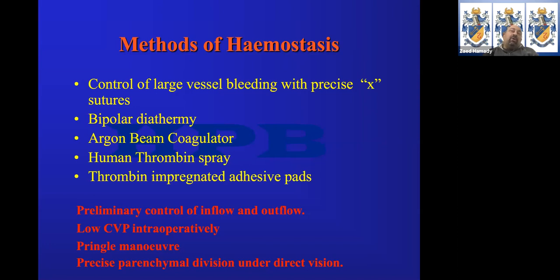the numbers. Usually I would wait 20, 30 minutes, and seldom do you need to use any of these clotting factors. And to be quite honest, we mostly use the clotting factors just as a finishing before we close up, rather than to control the bleeding. The Tacoseal, I must say, which is the adhesive pads, yes, we have used it when you have a slightly problematic bleeding from a bigger vein, such as the middle vein, and it gives good results. So probably I would say this is the most efficient product.